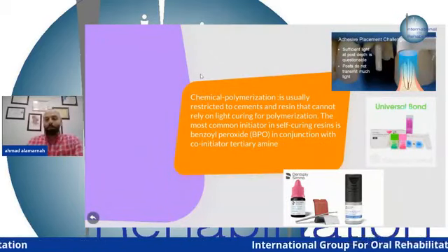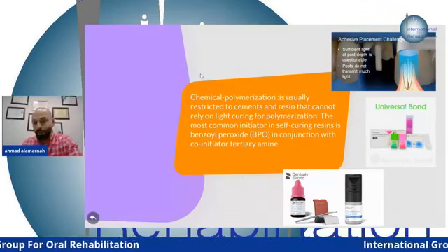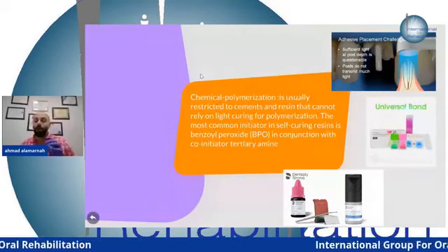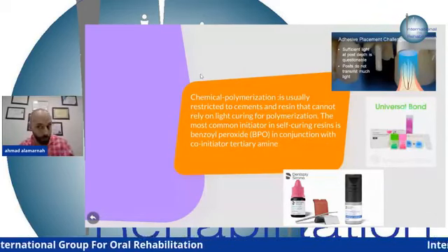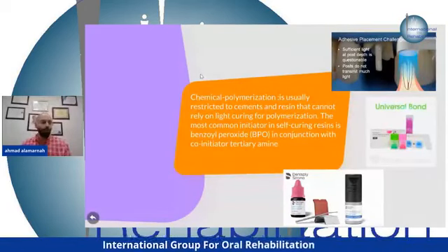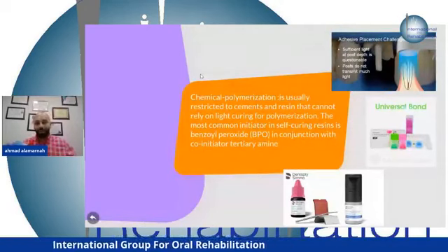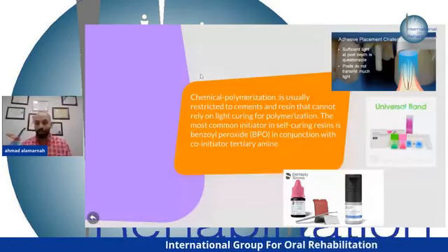Secondly, the chemical polymerization. This is a very important area to speak about. The chemically polymerized bonding agent is very important to use when you are dealing with a deep cavity, when you are dealing with a post and core, because we all know that the light of our light cure loses its strength, okay, with distance. Every 1 centimeter will cost you 50% of the strength of the light cure.